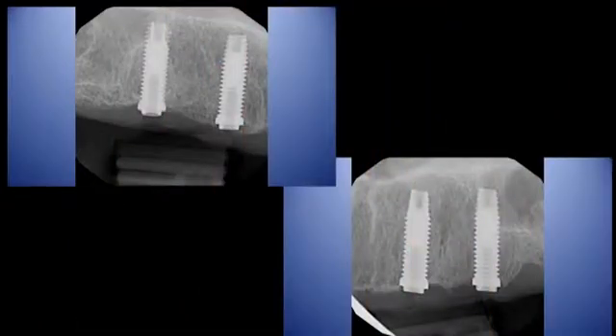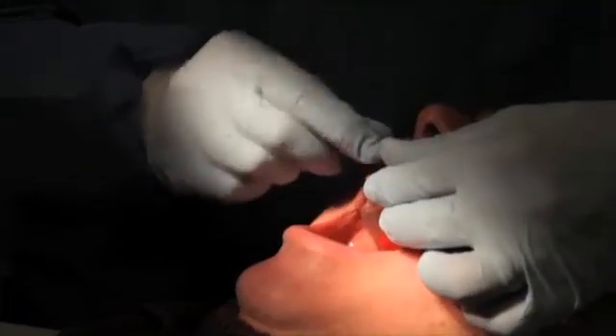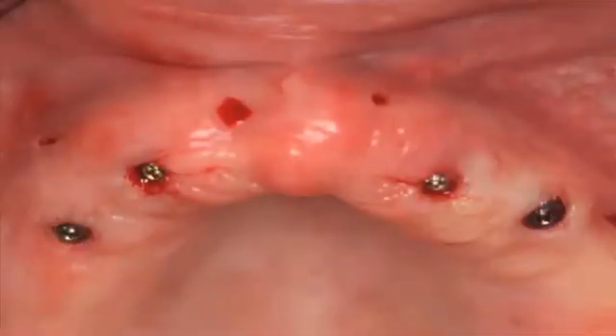Figures 16 and 17 are radiographs of the ideally placed dental implants. Evaluation of the maxillary right and left periapical radiographs demonstrate ideal positioning of the four parallel dental implants. These implants were virtually placed to be parallel and surgically placed to be parallel, which gives us a much better final aesthetic result with our attachments. The surgical guide was removed after extraction of the stabilizing pins. Note there is virtually no bleeding following implant placement and the labial pin placement — it's a very atraumatic surgery for our patient.